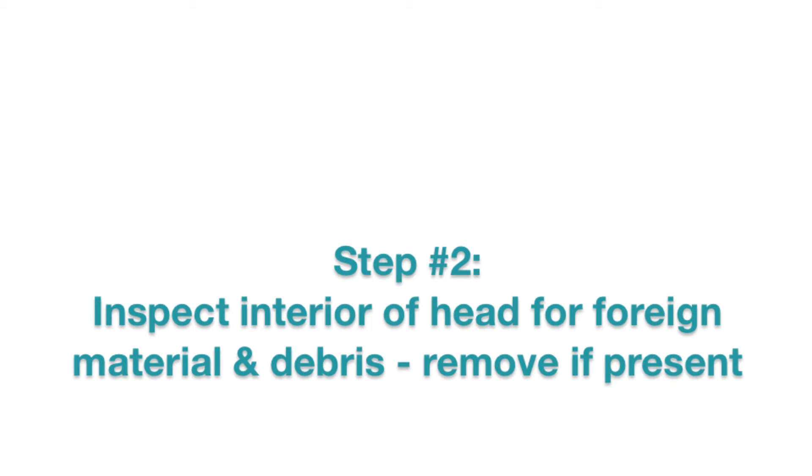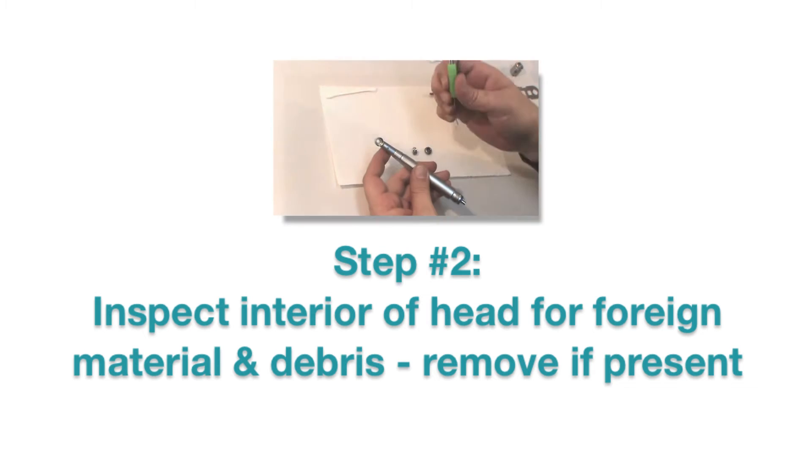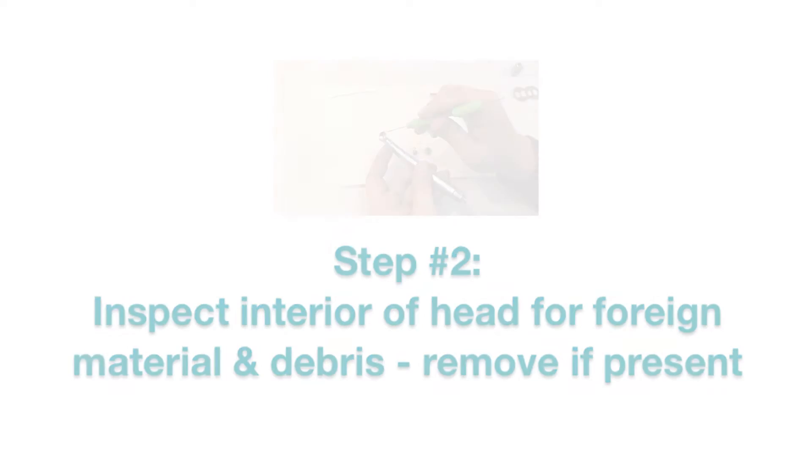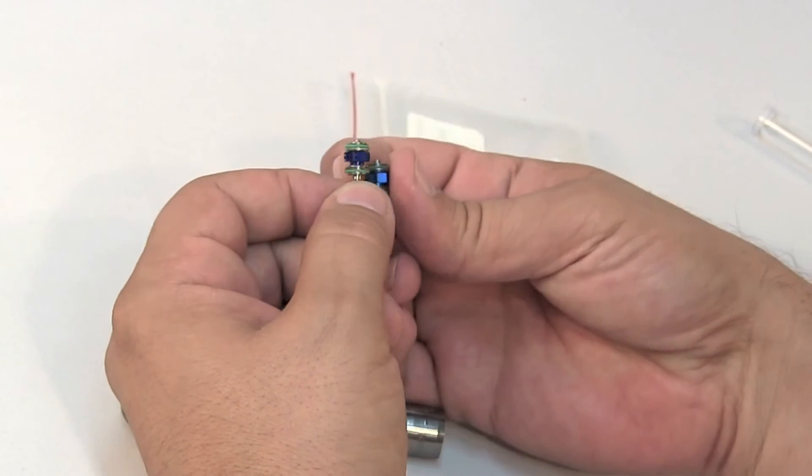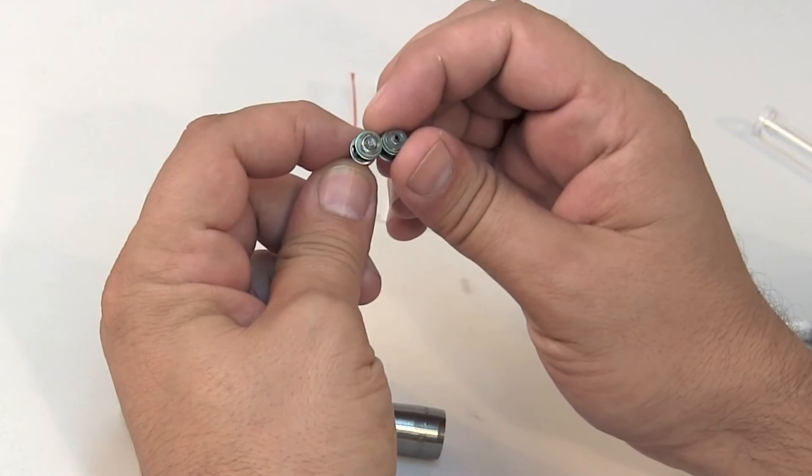Check the handpiece head for any debris. Use a scaler to remove any old shims, o-rings, washers, or bearing retainers. Compare the worn turbine to the new turbine to identify any components that may still be present in your handpiece.